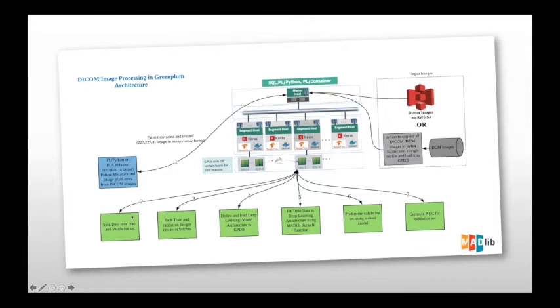Then you take that and split the data into a train and validation set, so that you build the model on the training set, and then test your model accuracy or AUC on the validation set. All the green boxes are MADlib functionality. MADlib is a framework available within Greenplum, which makes parallel and distributed machine learning and deep learning possible.